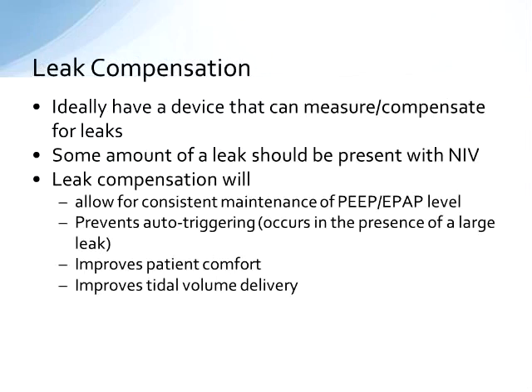Leak compensation. So you need to have a device that can measure, and ideally compensate for, leaks. Most of our freestanding non-invasive devices are able to do that pretty efficiently. A lot of our newer generation ventilators have non-invasive settings, and they're able to adjust for leaks in the system as well. So that's perfect. You should expect there ought to be a leak present in non-invasive ventilation.